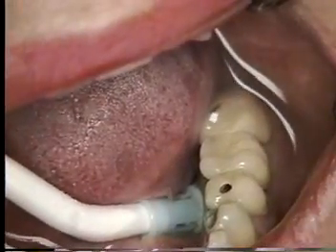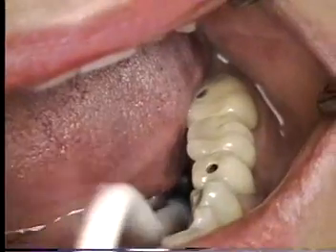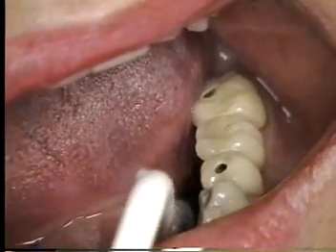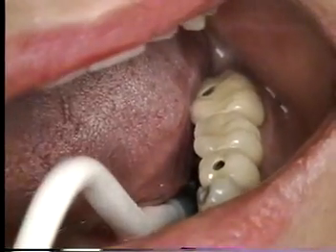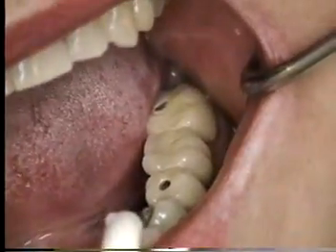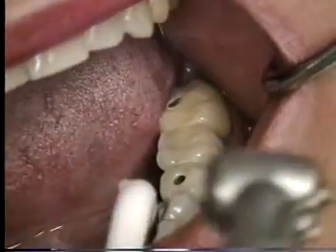You can see there where I've accessed the porcelain. I'm actually doing this without a dental assistant, so it makes it a little bit more difficult. At least my patient feels better now — she's laughing.